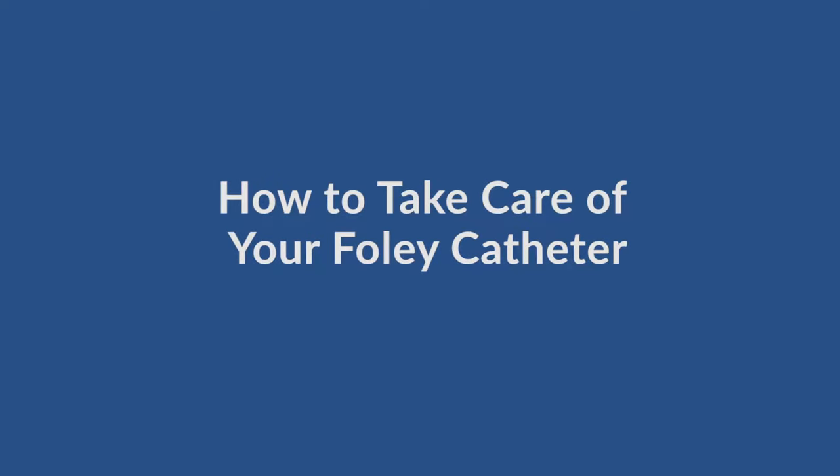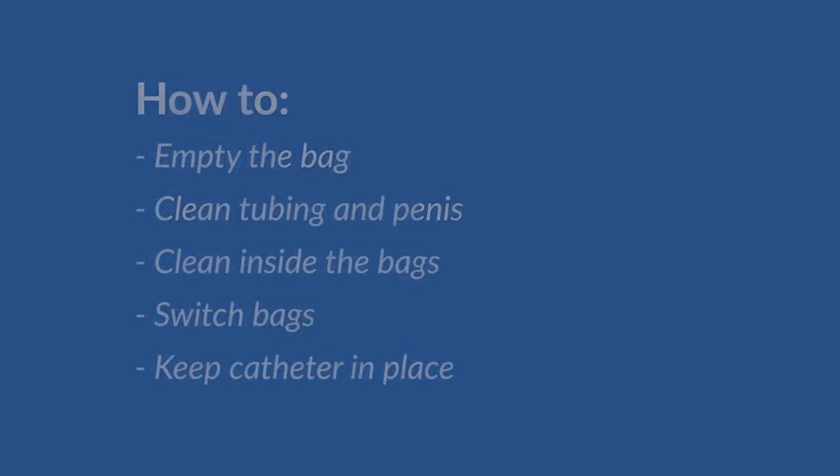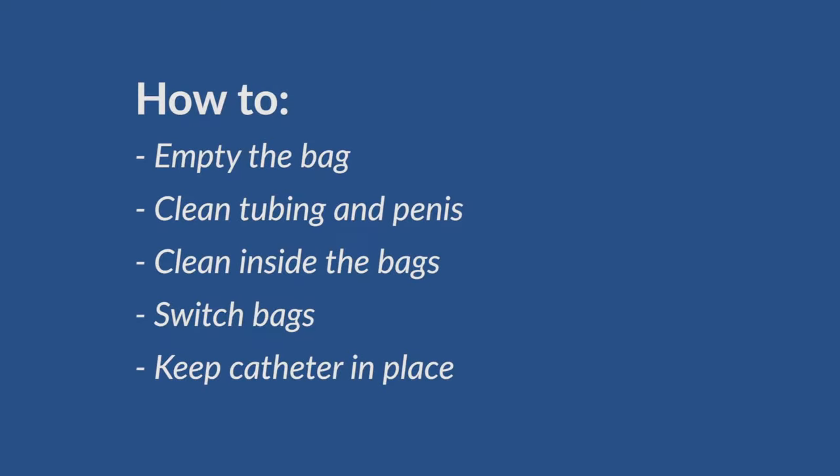This section will show you how to take care of your Foley catheter. We will show you how to empty the bag, clean the penis around the catheter, clean the inside of the bags, switch bags, and how to properly keep the catheter in place.